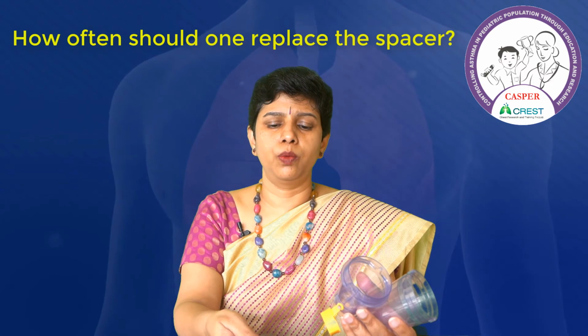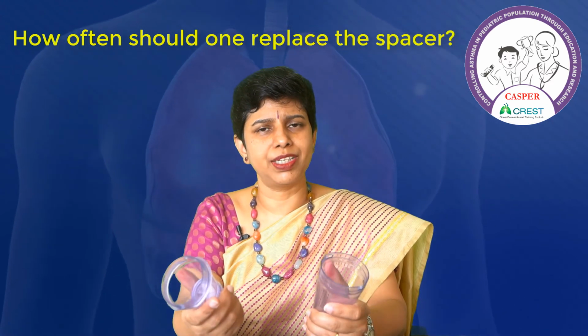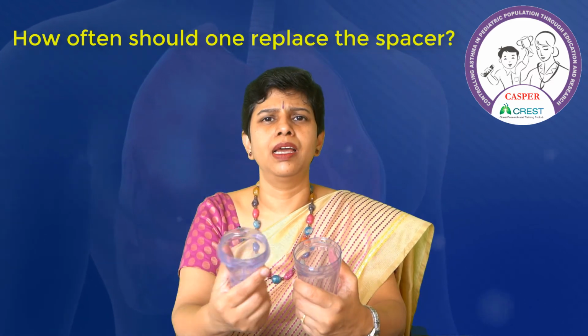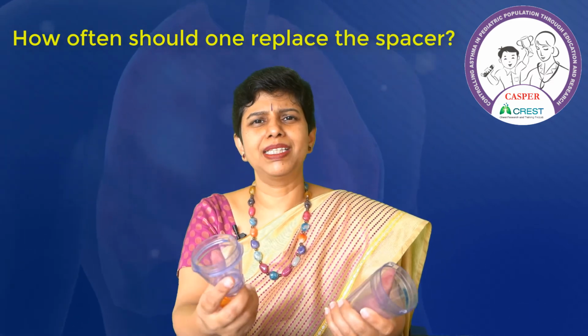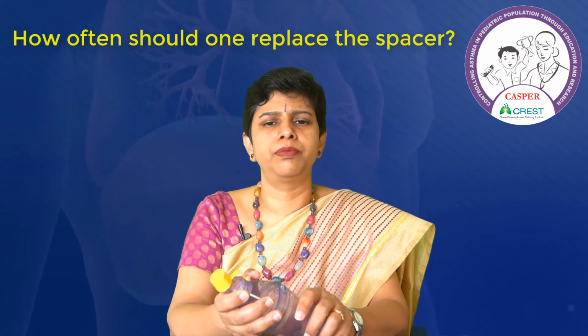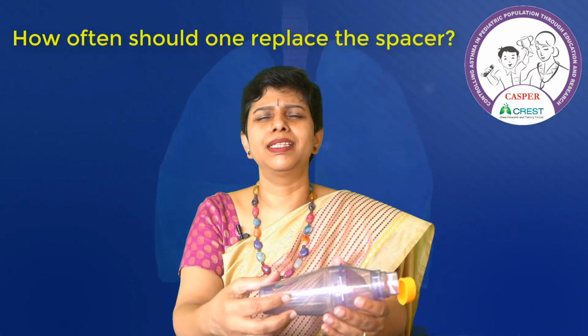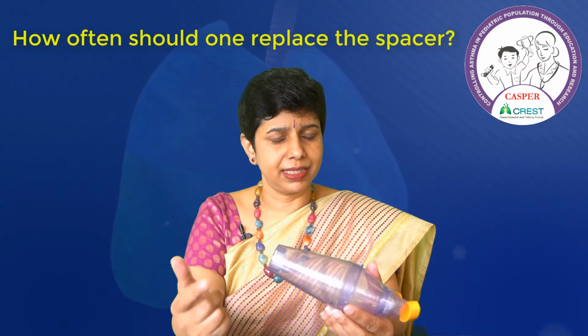What is important is that you have to make sure that the patient is replacing the spacer every 6 months, because 6 months is the life that is accorded to the spacer. In the worst case scenario, if the family is economically challenged, then maybe up to 9 months, but otherwise the spacer has to be replaced every 6 months.